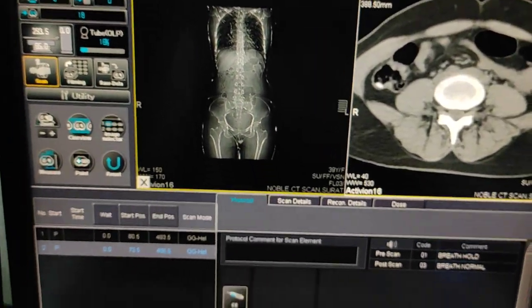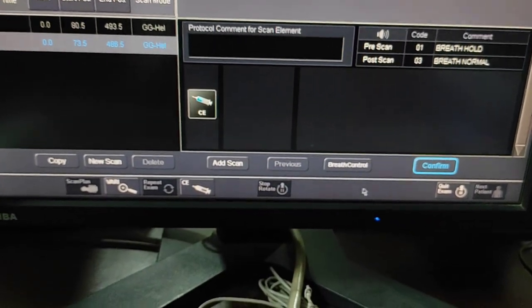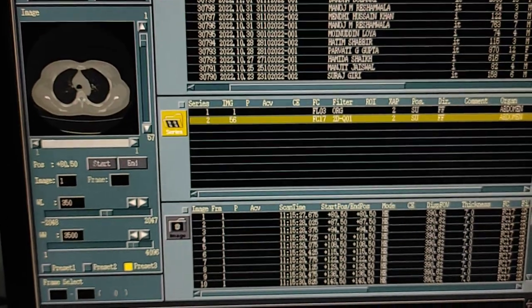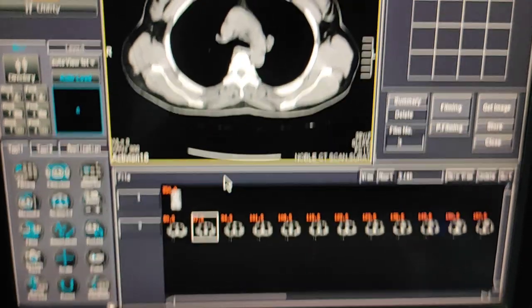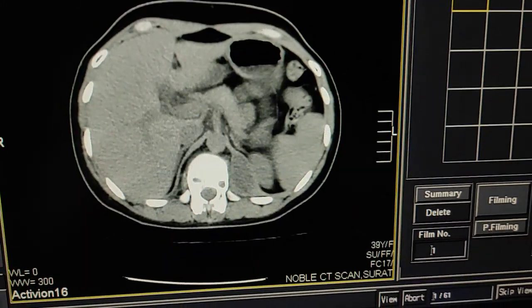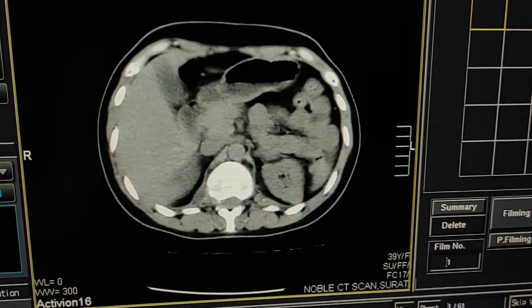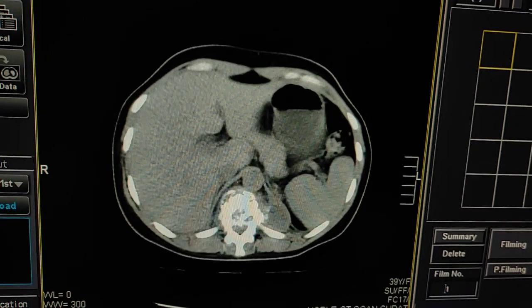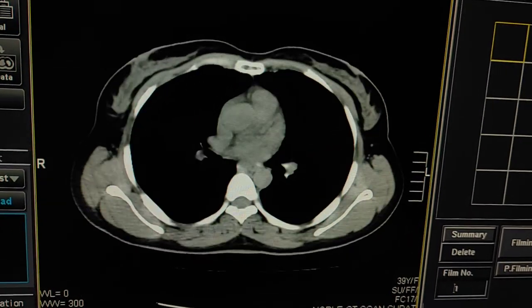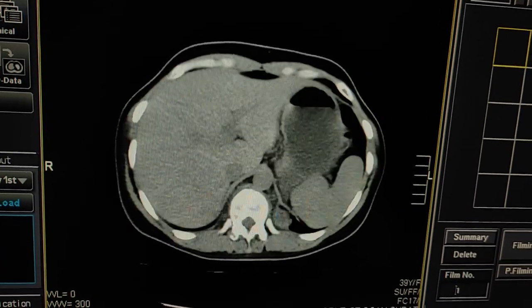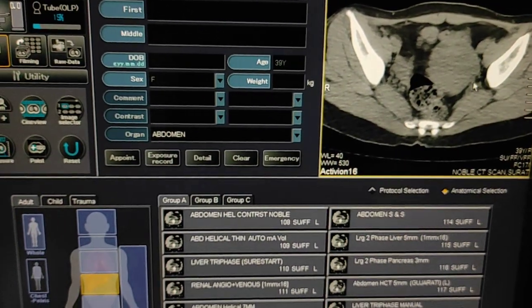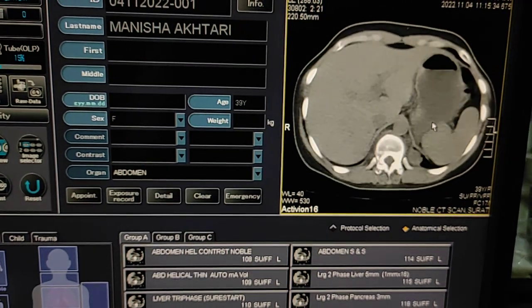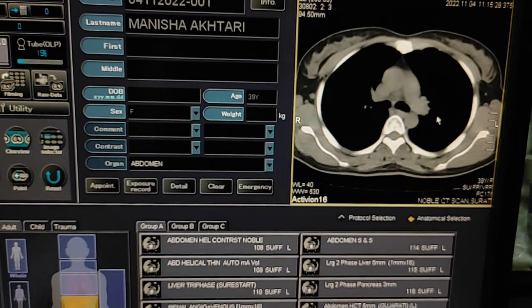Now quit the exam from here. You have to stop the rotation after the scan, then quit exam. I will go into filming to check the images and see how they are coming. After that I will show you how the recons work for this scan — these are soft tissue images. Here you can see the abscess. It must be Koch's. Scan is over now, you can take out the patient. There is no issue now.